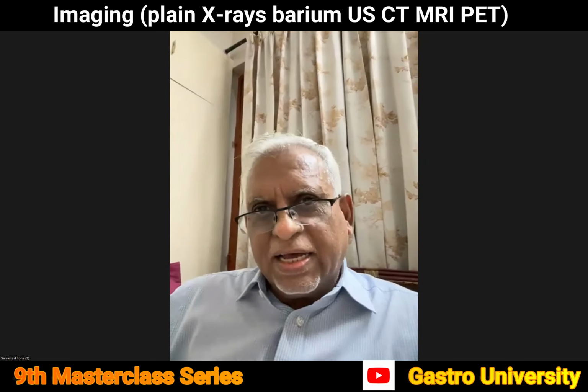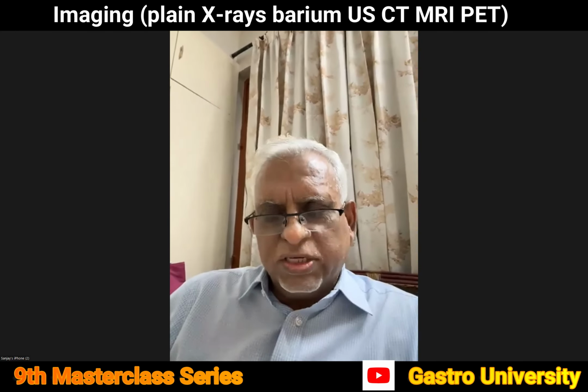What PET does is give you the lesion even in the solid organs of the abdomen, like you were talking about spleen and the liver. So you know which is the lesion from where you can take tissue or biopsy, which you are not able to find on ultrasound and all. So it gives an overall holistic picture of the disease burden, and a likely point from where you can take the tissue and make the diagnosis. Still, at times when you take tissue, I know that the molecular part has not yet been discussed, you still fail to establish tuberculosis from the tissue sample or the fluids from the loculated cavity or peritoneal masses, whatever.